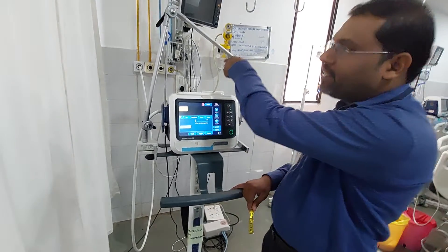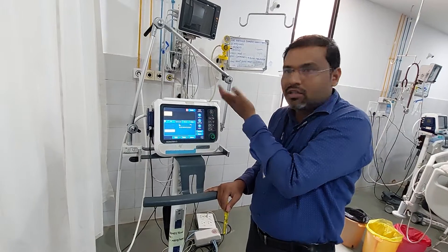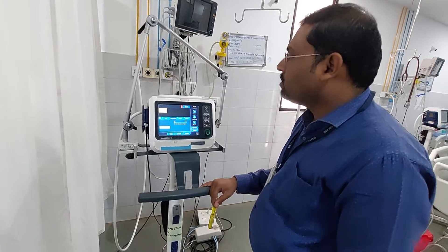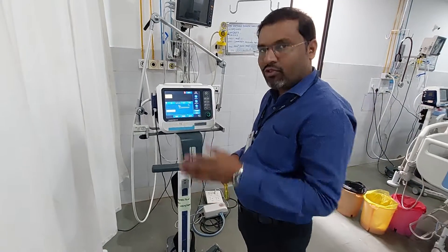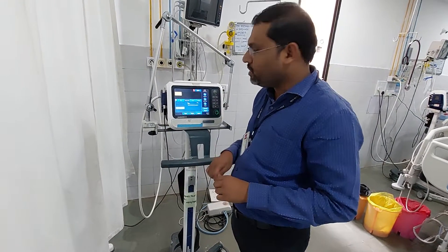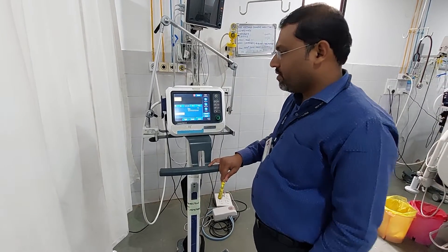We have connected central oxygen already. There are two types of calibrations: without central oxygen you can calibrate the machine on 21% atmospheric oxygen, or if connected to the central line you can perform it on 100% FiO2.